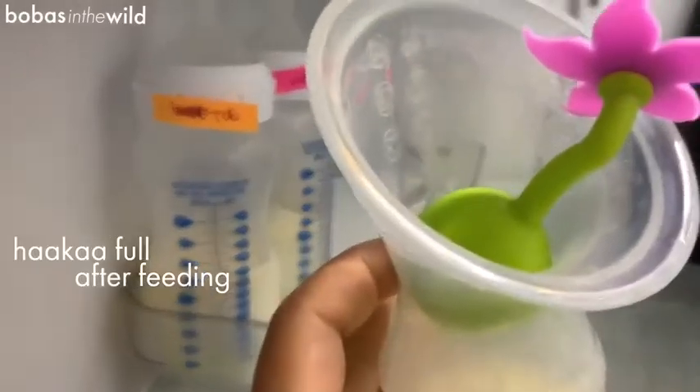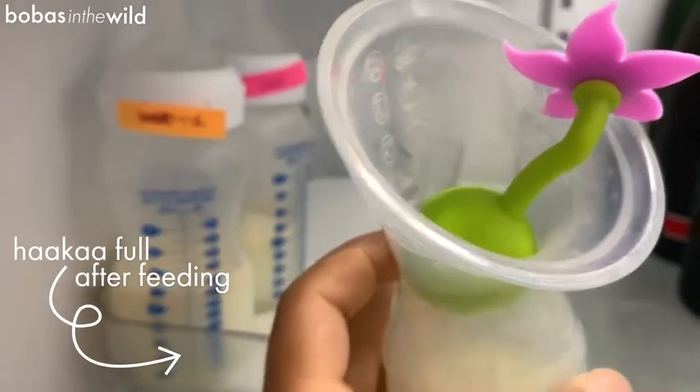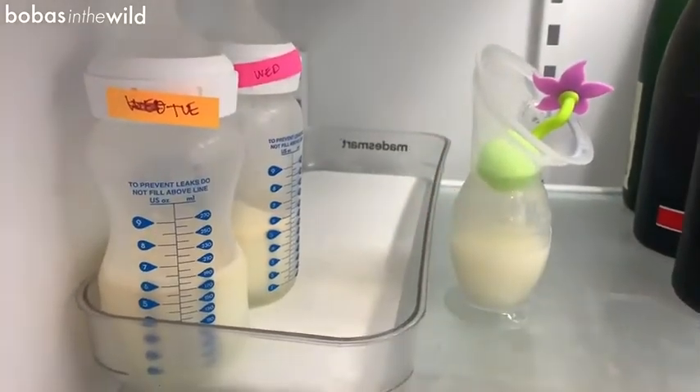Why do I need two? Tip number two: it will save you some serious time on baby dishes. You take one haakaa after feeding, it goes in the fridge, you let it cool down to temperature. Meanwhile, you've got your other haakaa ready to go for the next feeding.